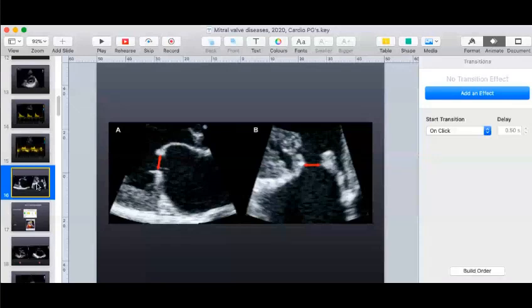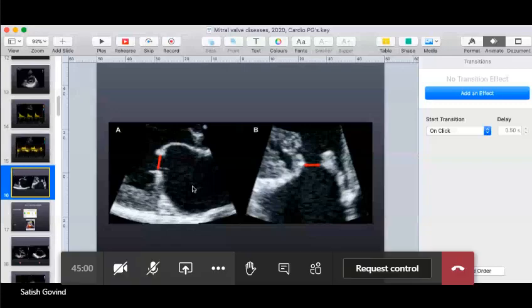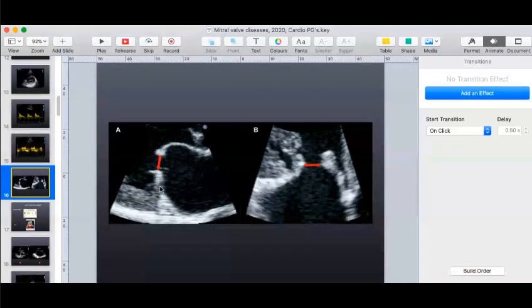You must have heard of mitral leaflet separation index, right? Okay. So this is again not a very sensitive one, especially when it comes to the lower degrees, low severity of the mitral stenosis. It generally tends to work better in a more severe mitral stenosis. So the principle behind this is that you look at the separation here in the parasternal long axis, measure the distance between this to this, and then whatever you get, you take that value, and then you go to the four chamber here and do the same thing. And then you take this average here, and then you look at the value. So if it is less than 8 millimeters, the mitral stenosis is going to be severe.